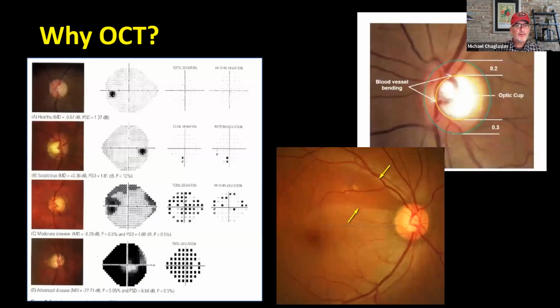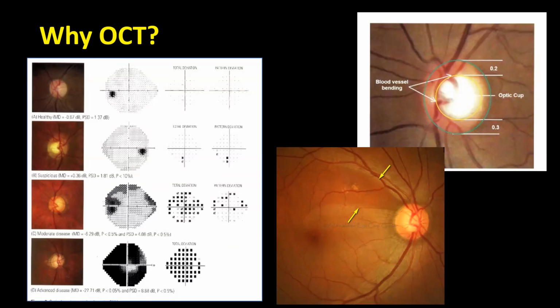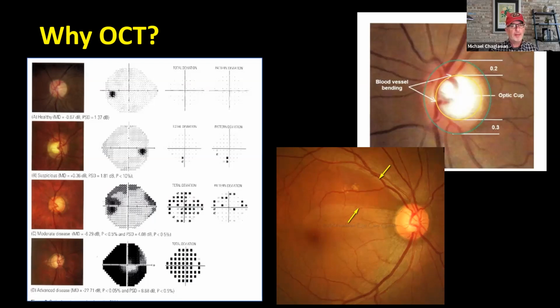So let's start off by just asking, why OCT? It's relatively obvious in 2021 why OCT is such a critical part of the diagnosis and ongoing management of patients with glaucoma. But what I want to take you through this evening is to really understand the best practices and the best tips that I can provide, so that using the technology in your office as directed for glaucoma patients and glaucoma suspects is really an expert tool in your expert hands.